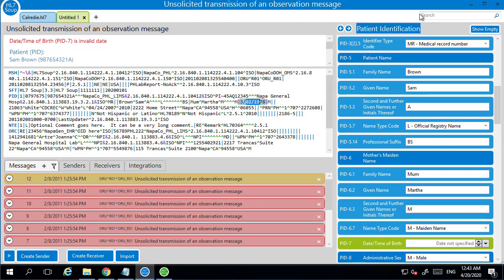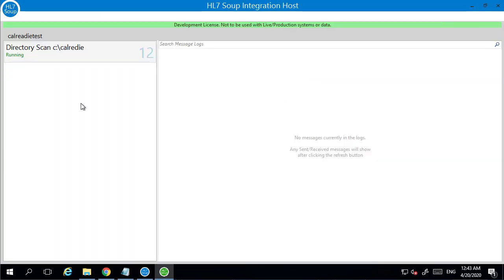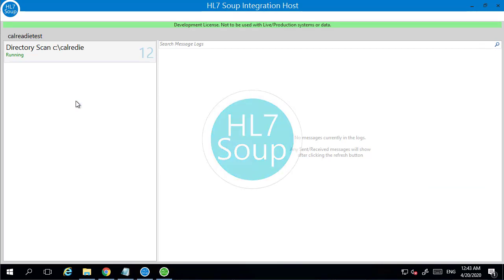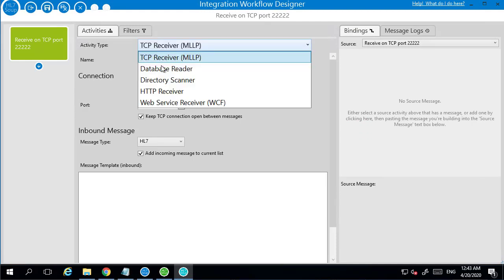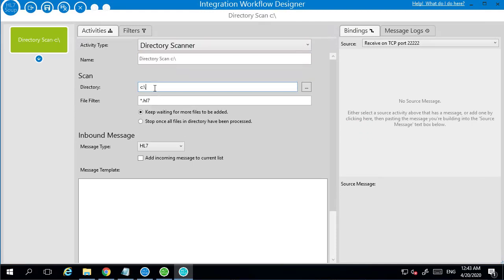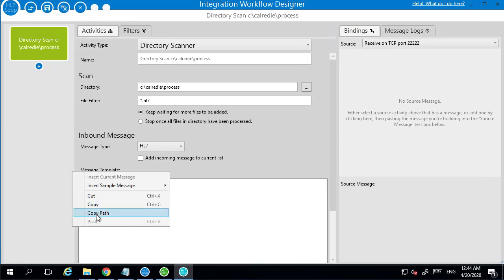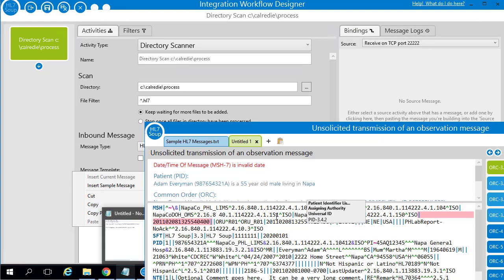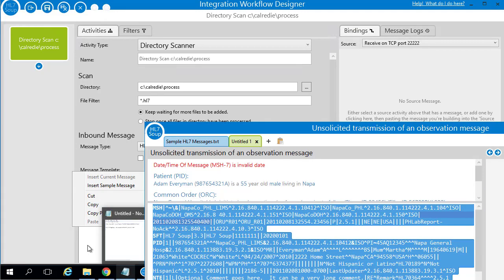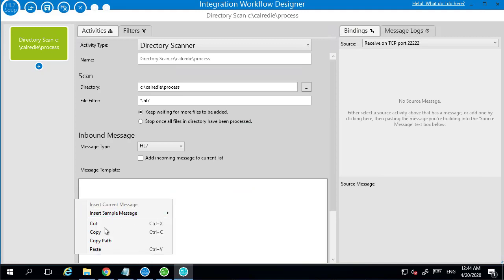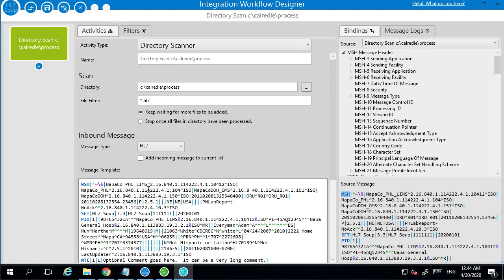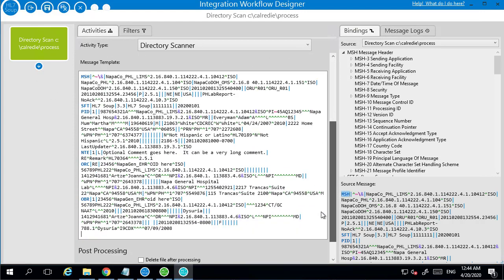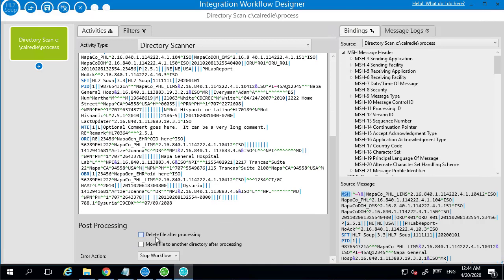So now we're going to create another step to this process where we're going to read those values in and send them through to CalReady. So in order to do that, I'm going to create a new workflow. Again, I'm going to do a directory scanner. I want to pick up that C process CalReady directory. I'm going to pick up all the HL7 files from there. I just want to add in a message template. That's just a sample of what's coming in, it doesn't matter too much at that point. And once it's processed that file, we'll set it to delete after processing.